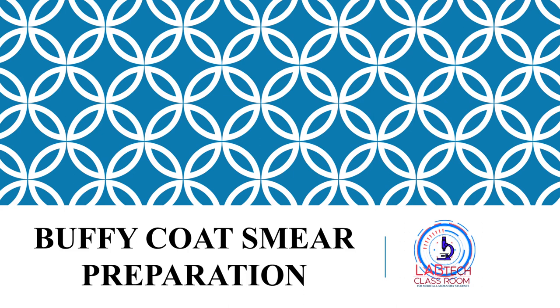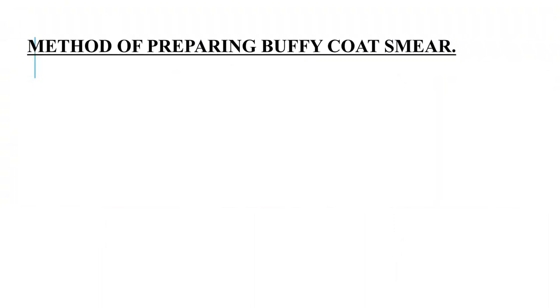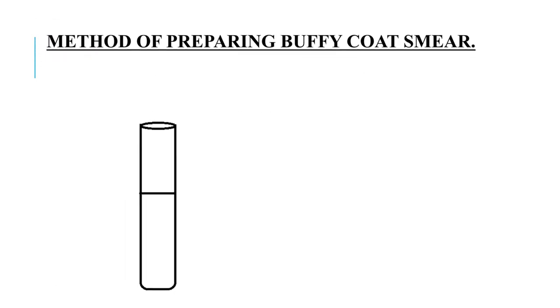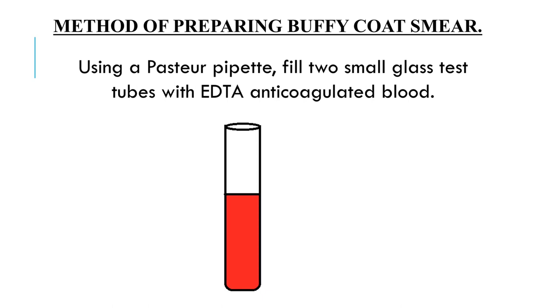Buffy Coat Smear Preparation. Today I would like to discuss the preparation and use of Buffy Coat Smear. Using a Pasteur pipette, fill two small glass test tubes with EDTA anticoagulated blood.